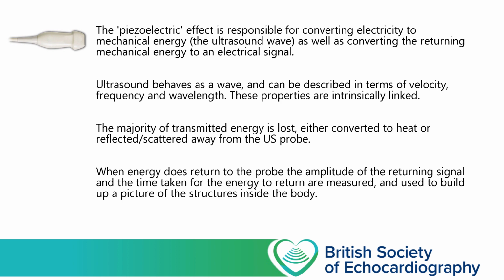The ultrasound beam that we pass into our patients behaves like a wave, and the key properties of that wave are its velocity, its frequency, and its wavelength, and these properties are linked intrinsically. Most of the energy that we send into our patients is lost, it never comes back to our probe, with the vast majority being converted to heat. But when that energy does come back to our probe, we can measure how long it took to get back to us and how much of it returns, and use that to start building up a picture.